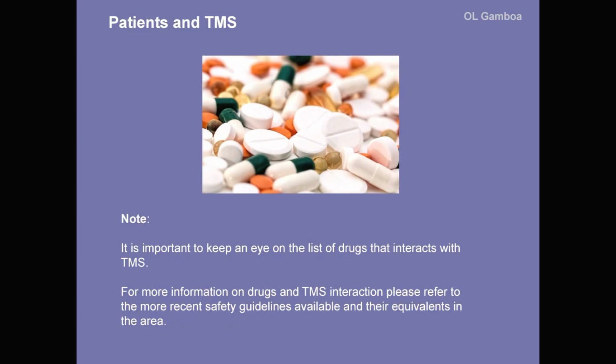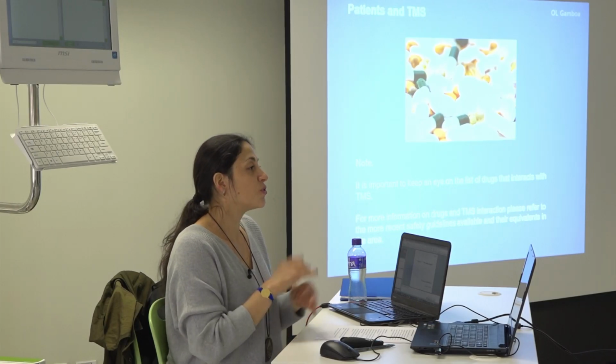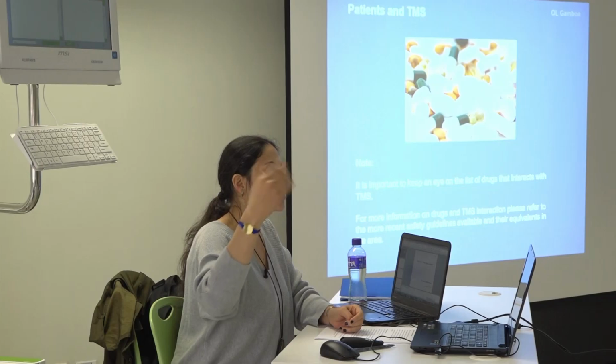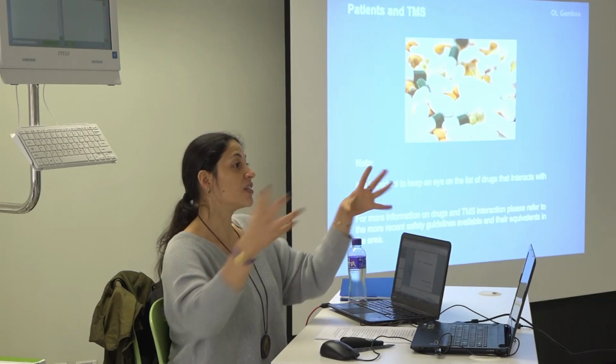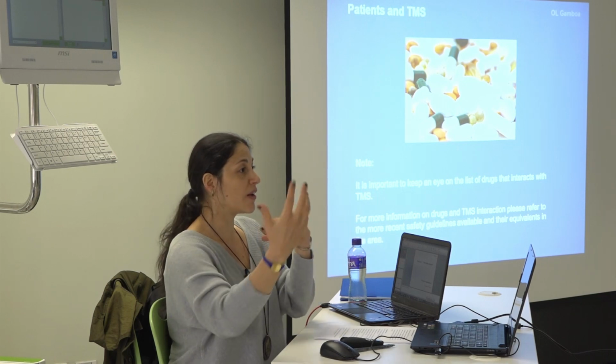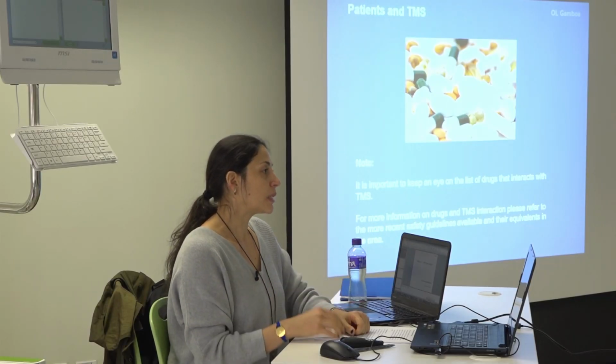So for more information about drug interactions, go to the safety guidelines. Next year, I think, the new safety guidelines will come; they update every 10 years. They will say which other drugs, or the experience they have had, like all the big heads in TMS get together and talk about their experiences and review the literature. You will have some new stuff there, but also talk to your clinicians.